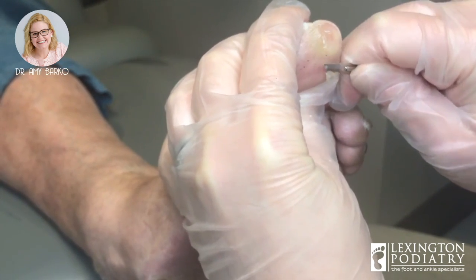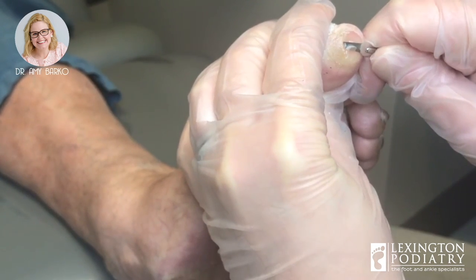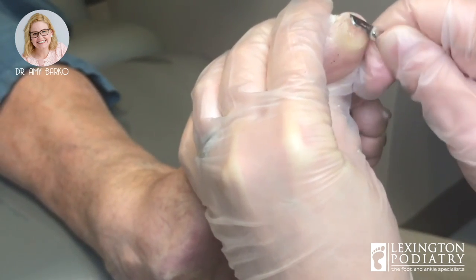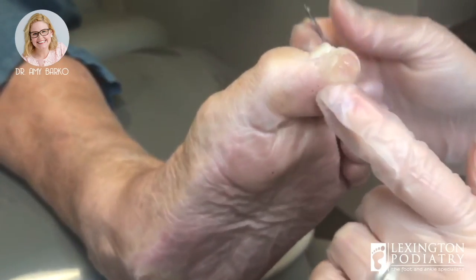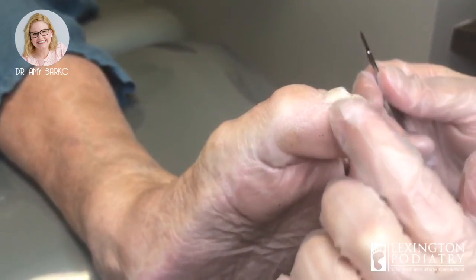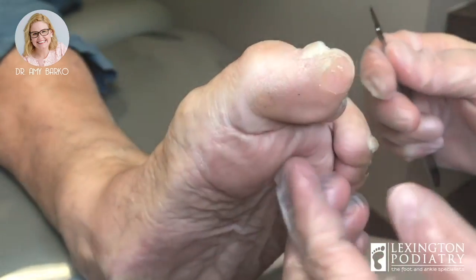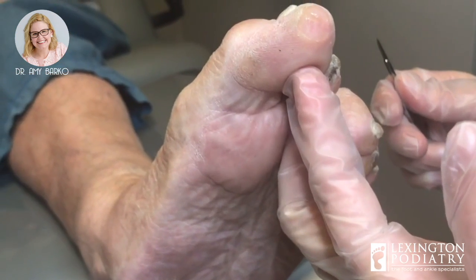Going to a doctor who is really good at this helps. I would say I'm good — I don't know about really good. When I was a student, we had a teacher who could trim a callus so well you would never even know it was there. He was so good. Here, I'm not too concerned about the ridge because one of my assistants will come in and help me buff that down with a Dremel. And there's a little bit up here. So this is how we trim a callus here at Lexington Podiatry.